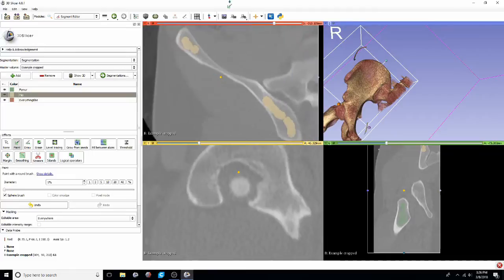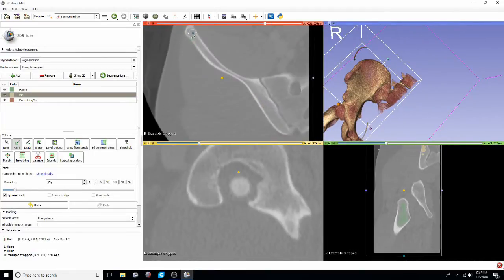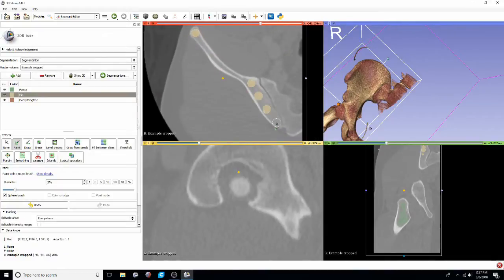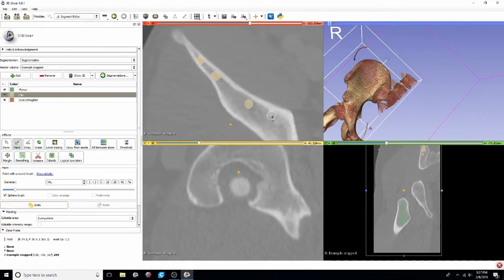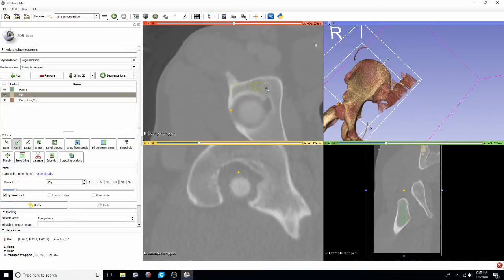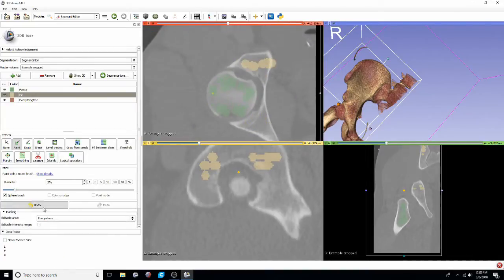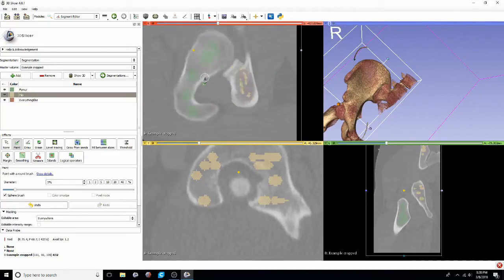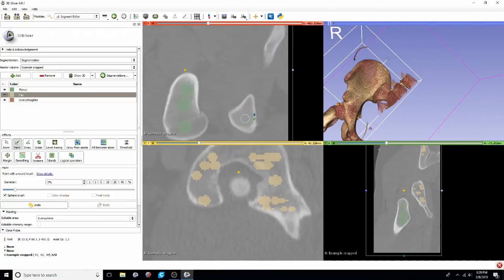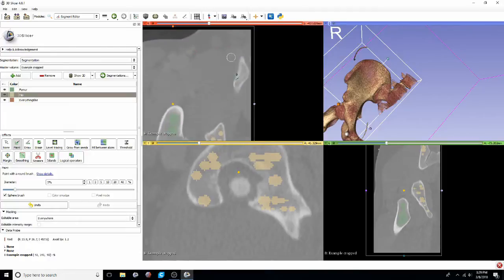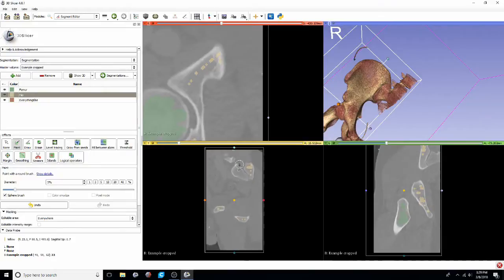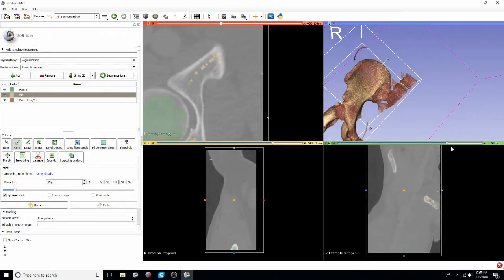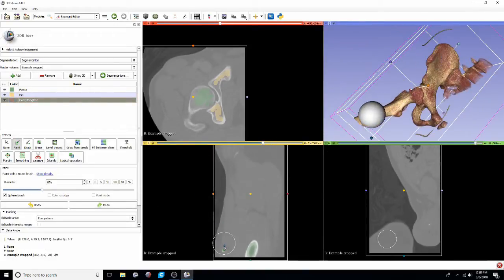But at the same time, you don't necessarily want to be labeling absolutely everything because that'll be quite time intensive. You kind of want to let the computer do as much work as possible for you in order to best segment out anatomy, especially structures that are really close together. It's kind of why I've chosen this hip and femur because you have the femur abutting the acetabulum. You'll really want to get the label as close to the edge of the bone as possible. The more seeds that you ultimately give the computer, the better that first pass of the segmentation will be. But don't worry, we can always go through and edit the segmentation to make sure that we have captured everything.